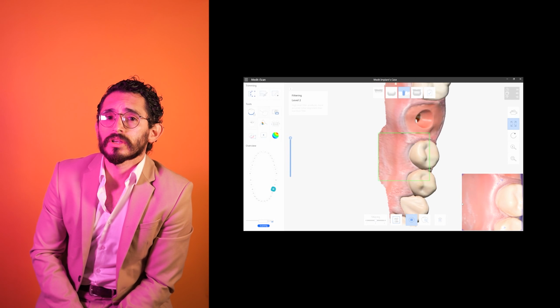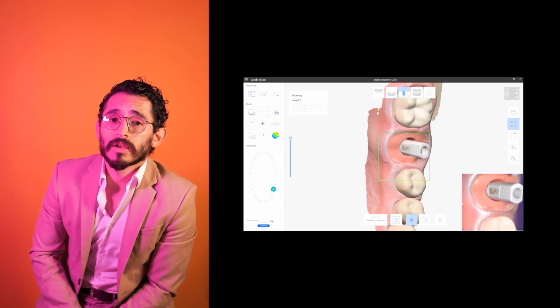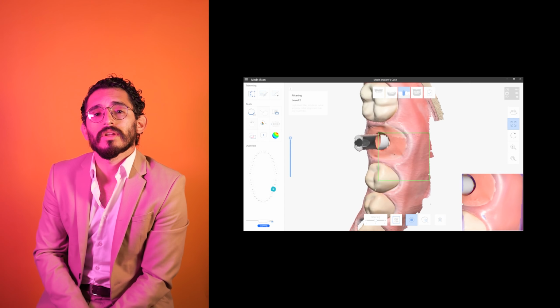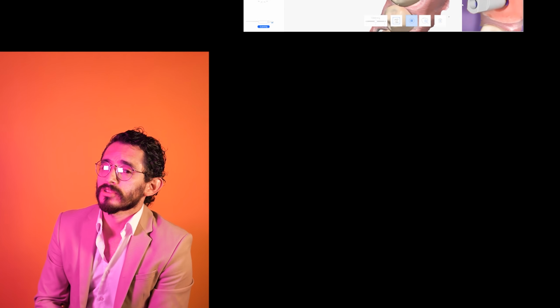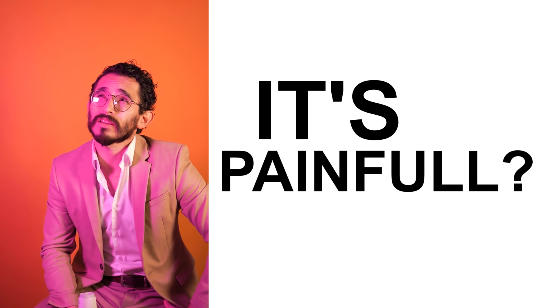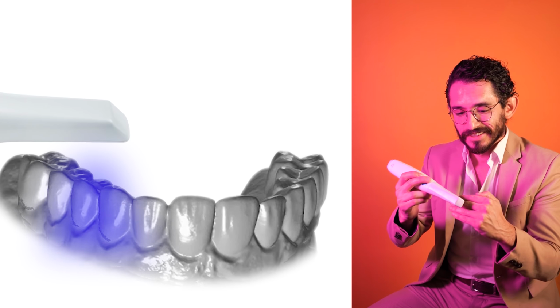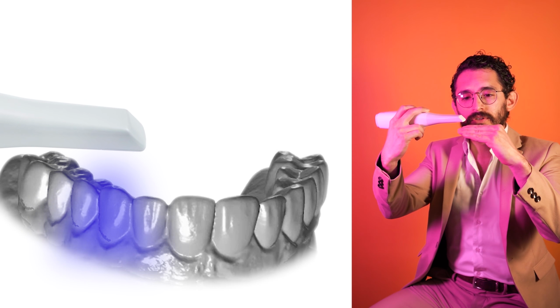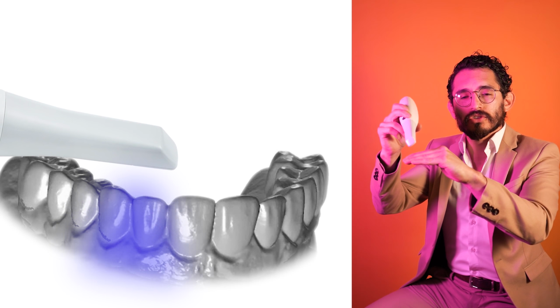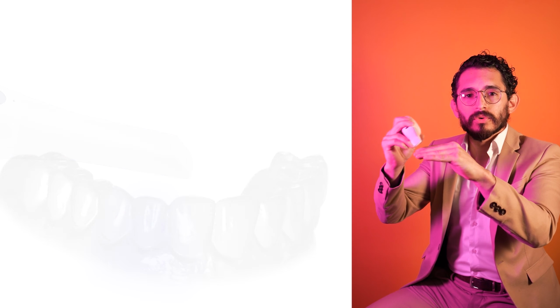We use some attachments that allow us to pick up the position of the implants without having to take an impression again. So it is very quick and it is very precise. No pain. Actually, think of it as brushing your teeth, but without touching your teeth. So this is going to basically be suspended over the structure, and it's just going to be recording everything.